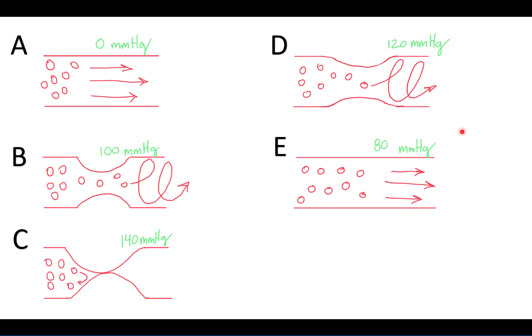So let's go through this again. Let's remind ourselves, this is where we're at rest. We've placed the head of the stethoscope on the artery. We do not hear any sound. There's laminar blood flow. We begin to increase the cuff pressure to a point where it partially occludes the vessel, at which point we might start to hear a knocking sound.